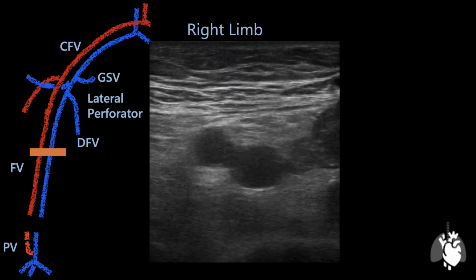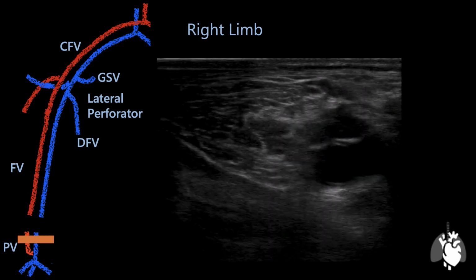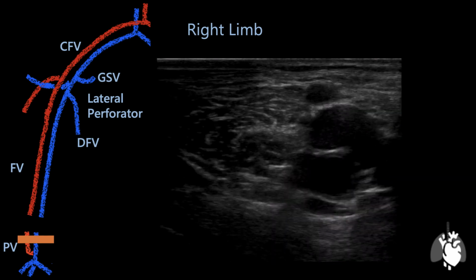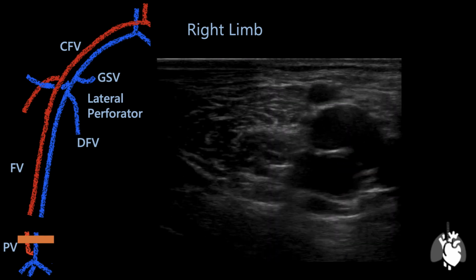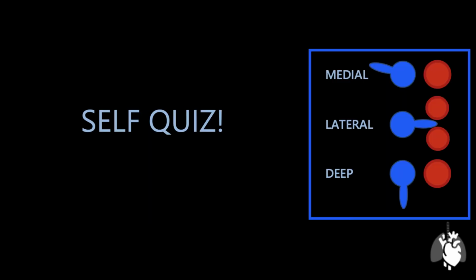Don't forget the popliteal. This vein can be tricky to find in some patients. It's very superficial and easily collapses with just a little bit of pressure. The key is to be very, very gentle. Once it's been found, trace and compress it as proximally as possible, and then as distally as the trifurcation. The trifurcation is technically the end of the deep system, and the management of clots found below the trifurcation is different than that of the deep venous system and will not be discussed today.